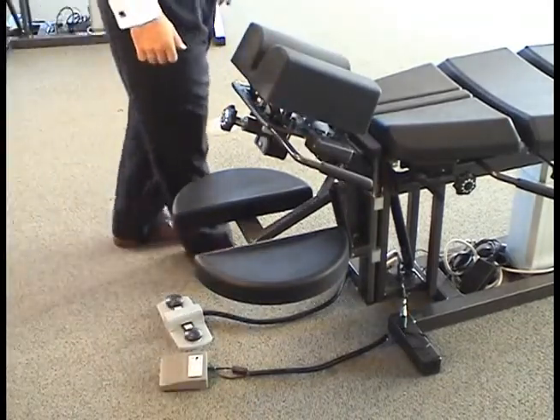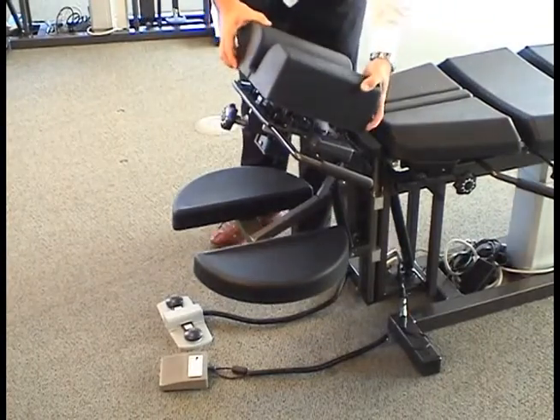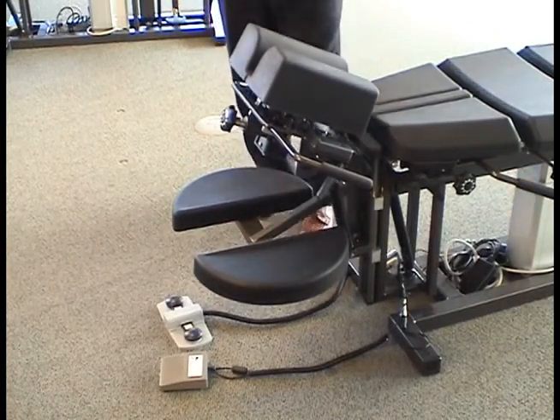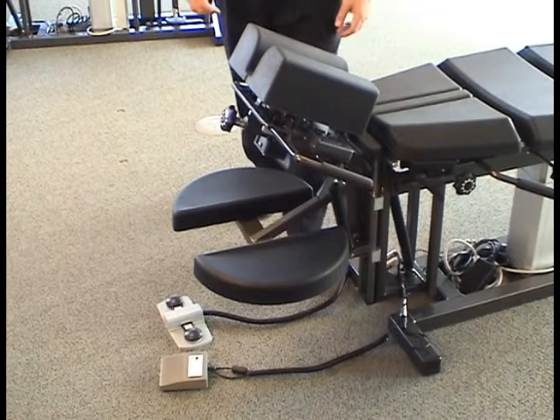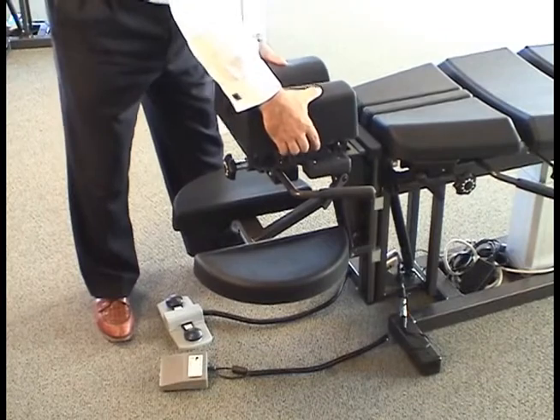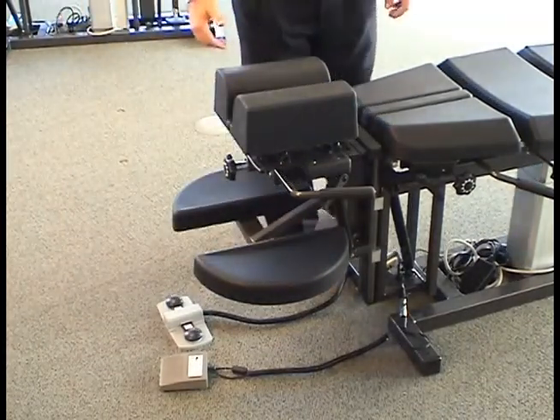Some PCT models can be favored or biased to drop cephalad or caudad. Other PCT models will only drop cephalad. If your model drops both cephalad and caudad, it is required that the practitioner favor or bias the headpiece cephalad or caudad prior to use of a drop.